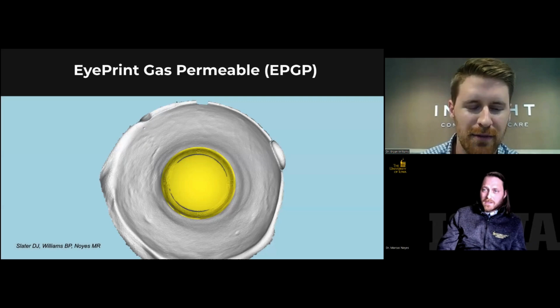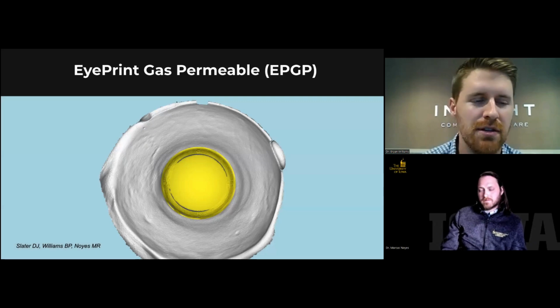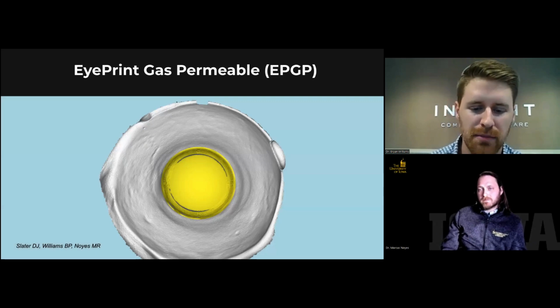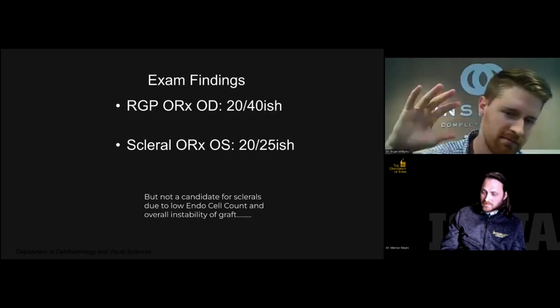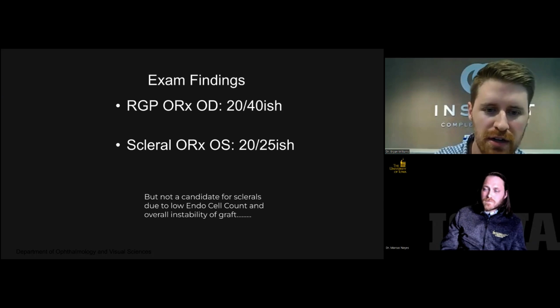And tried, go ahead. Can you get into a little bit more of what's your magic number for an endothelial cell count, or do you have one, or do you kind of just bird's eye view the whole scenario, taking into account the graft and everything like that?